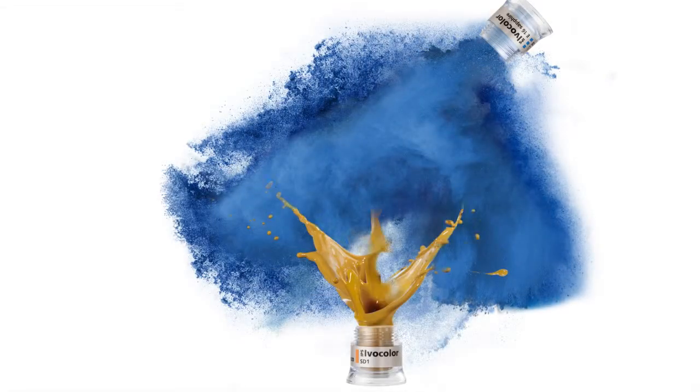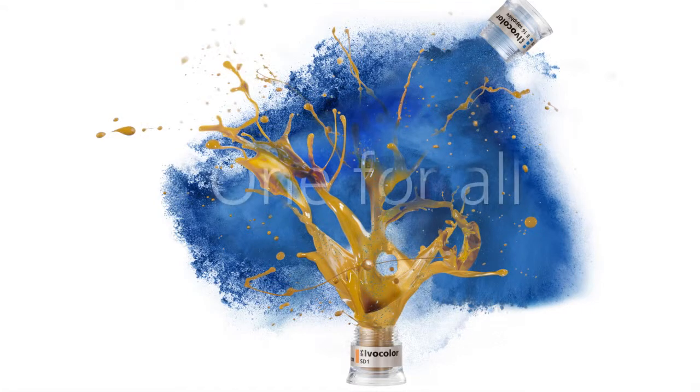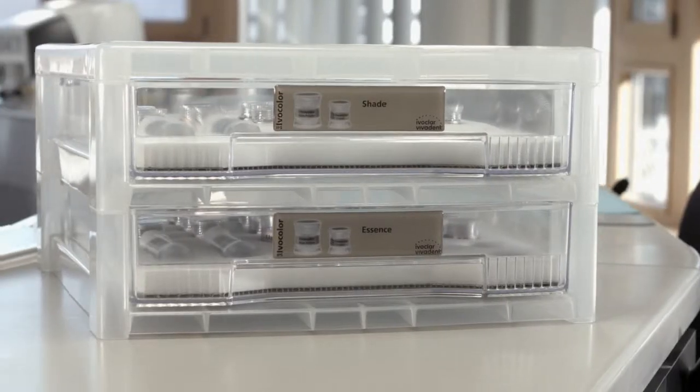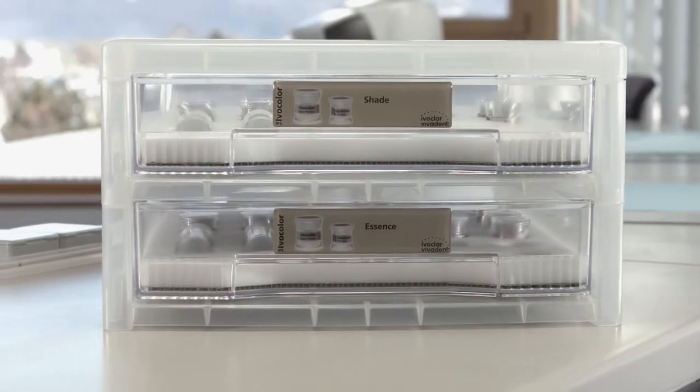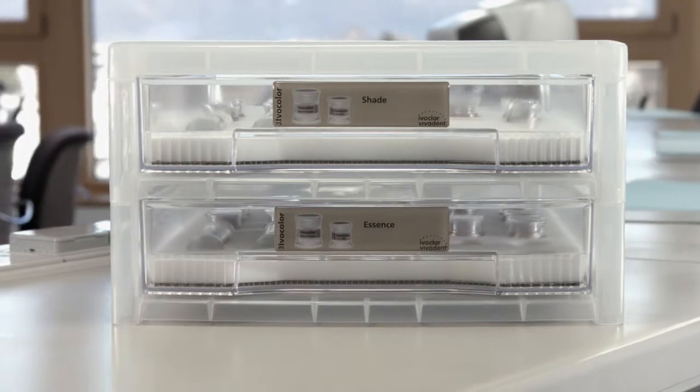IPS Ivocolor is a universal stain and glaze system for the individual characterization of pressed ceramics, CAD-produced restorations, and layering ceramics from Ivoclar Vivadent and Zenostar from Wieland Dental. The stain and glaze assortment is available as a starter kit, shade kit, essence kit, and in single refills.